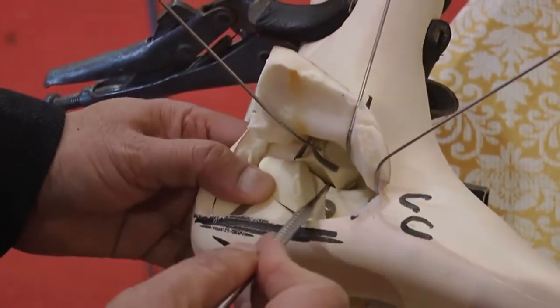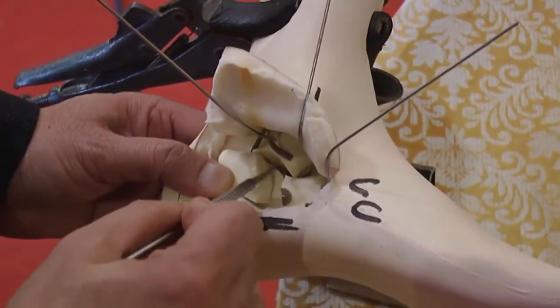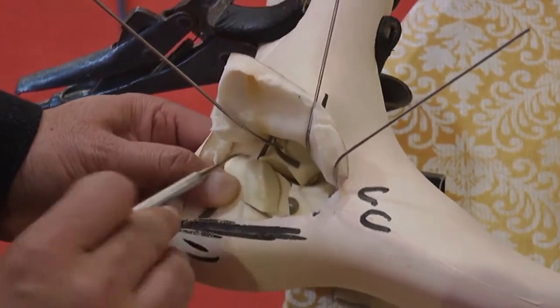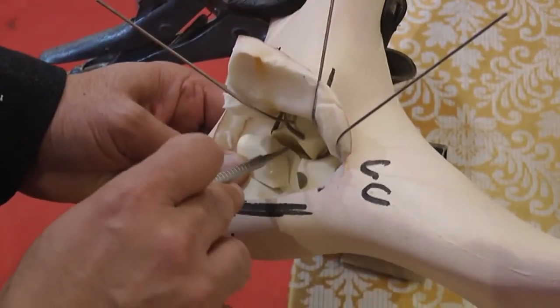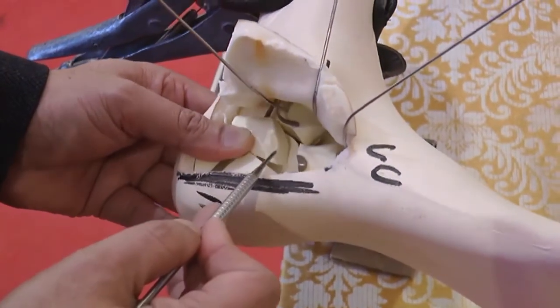The medial fracture line is in place with the stable sustentacular fragment, and the lateral facet is depressed, which was covered by the lateral wall. Having removed the lateral wall, you are now able to see, by inverting the heel, the medial fracture line, and that is the fragment which has to be lifted.